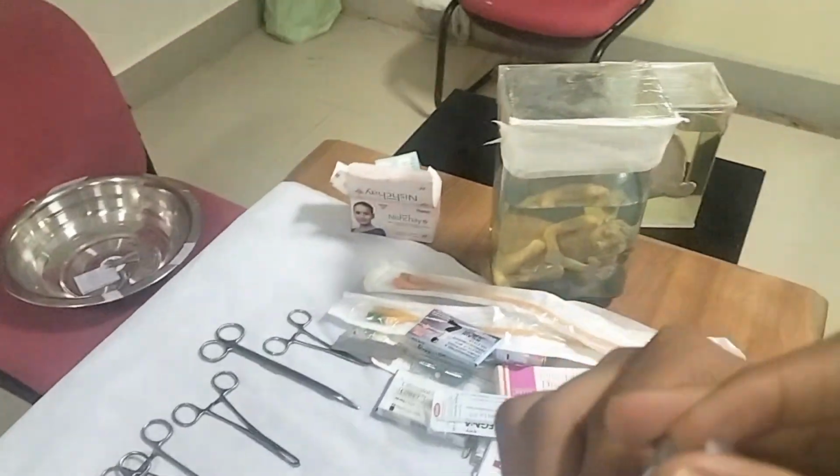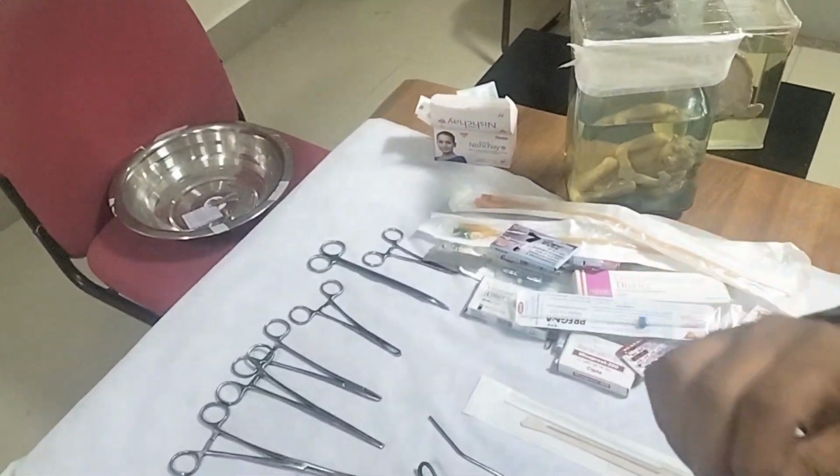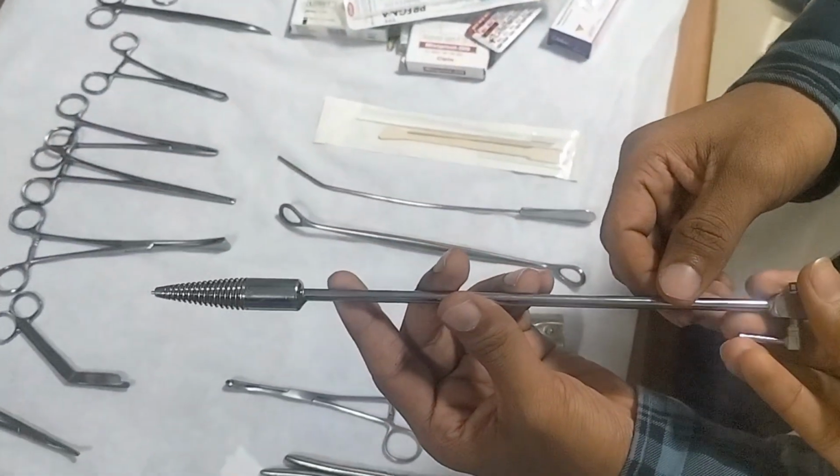And from behind you can see, you can remove it like this. Okay, it will come. It is used for hysterosalpingography also. Okay, this is Leech Wilkinson's cannula.